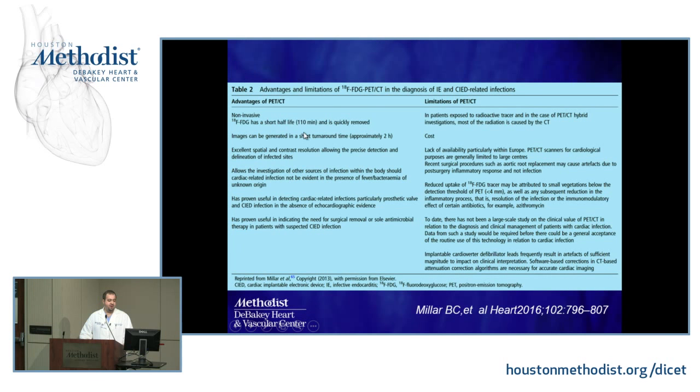So what are the advantages of PET CT versus disadvantages? It's non-invasive. You can acquire images within a turnaround time of close to 2 hours. You have excellent spatial and contrast resolution, which allows you to precisely detect and delineate the infected sites. Also, you can look for sources of infection elsewhere in the body, and it has been established as a diagnostic modality of choice in patients with prosthetic valve endocarditis and/or patients with pacemakers and defibrillators, especially in the absence of echo findings.